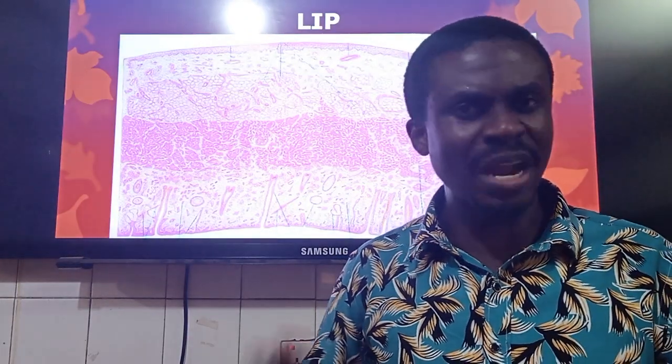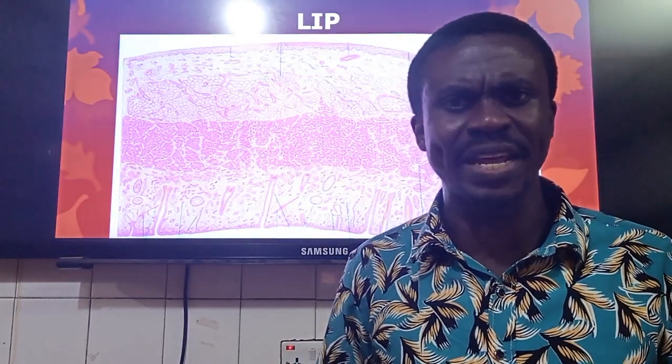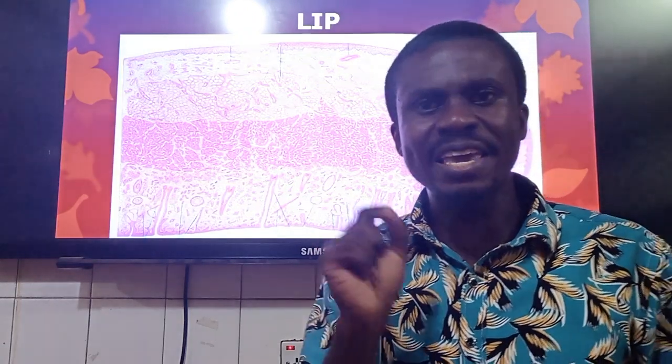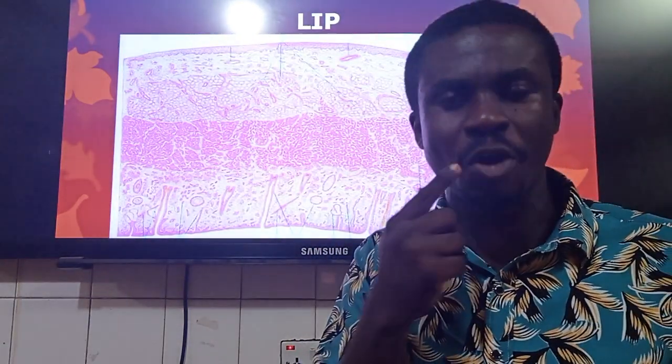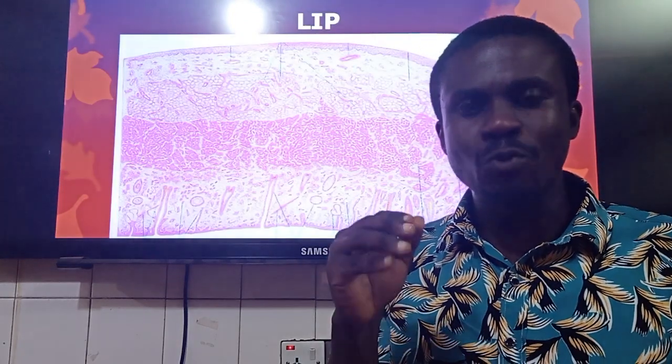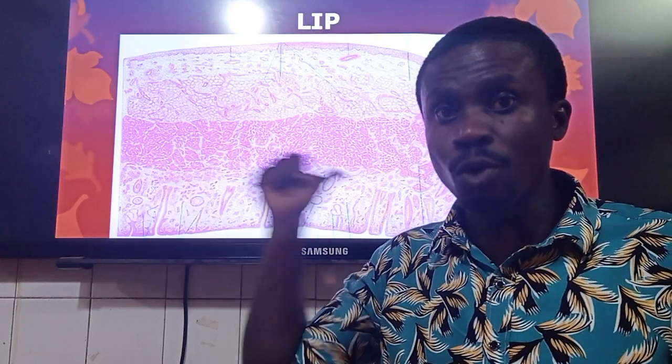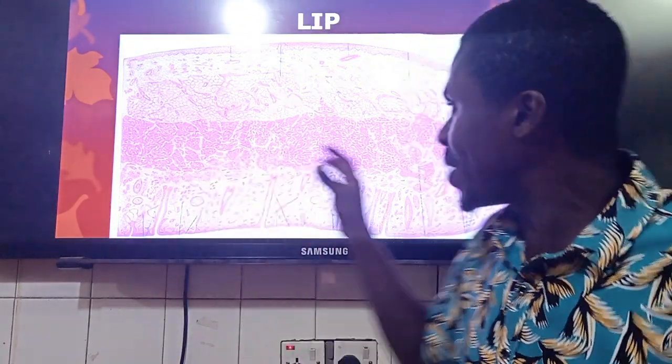Yes, wherever we have lamina propria, there will be blood vessels over there. There will be capillary loops and all that. They will be there. But the key thing, the reason why it appears pinkish or reddish, is that we have something called deeper connective tissue papillae. And I'm going to explain it to you in the next slide. So I'll be coming to this one.